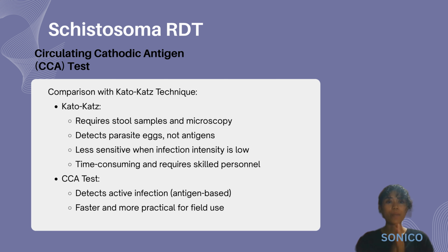In summary, rapid diagnostic tests provide a fast, practical, and accessible approach to diagnosing parasitic infections, although they are best used alongside traditional methods for improved accuracy.